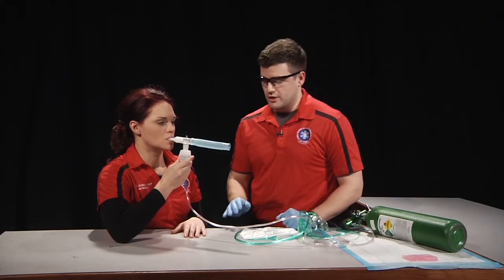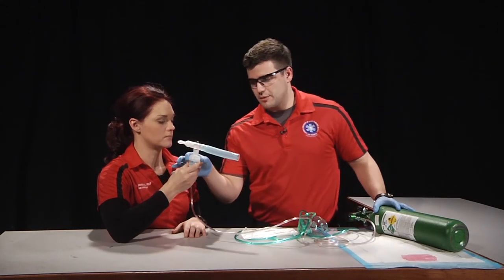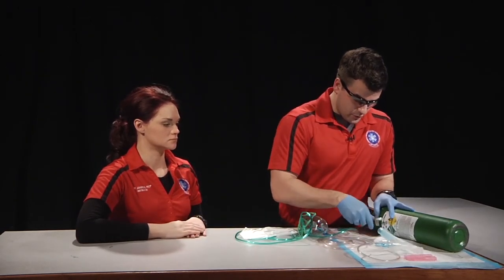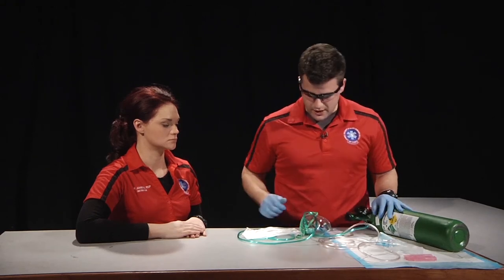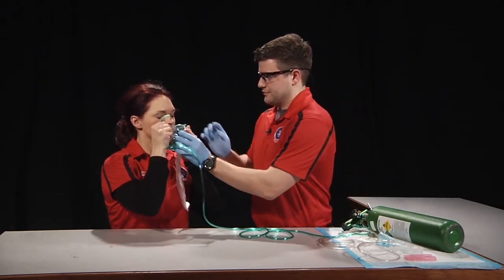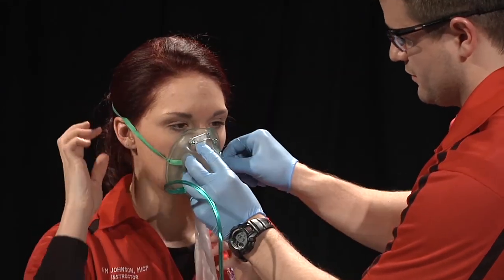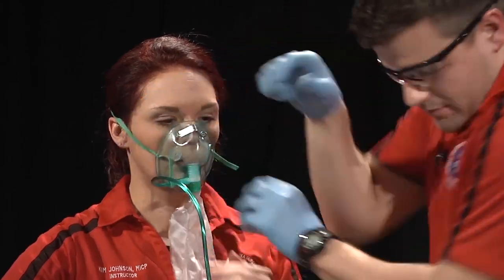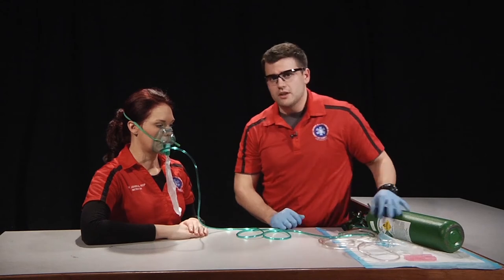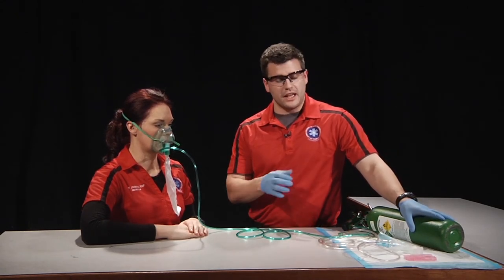Once the medication is gone, we'll go ahead and discontinue the oxygen, take the nebulizer from them, disconnect the nebulizer, and reconnect our non-rebreather, and assist our patient in putting the non-rebreather back on. Then turn the oxygen back on to the appropriate setting, and we're now going to monitor our patient for desired and adverse effects of the medication that we administered.